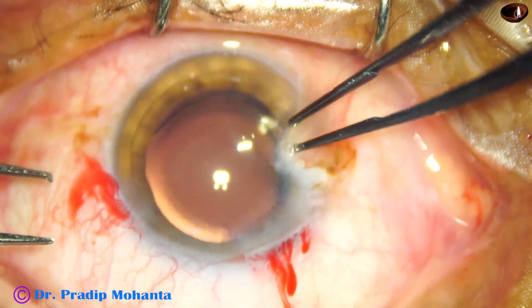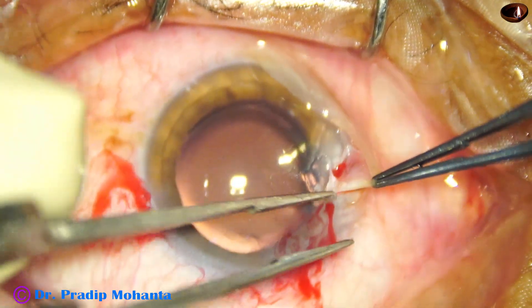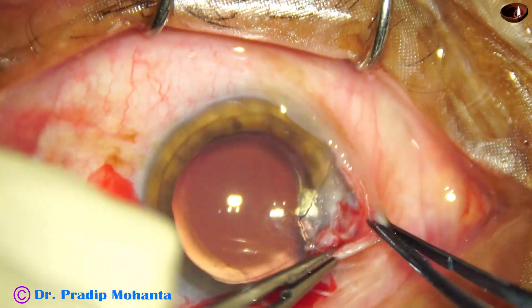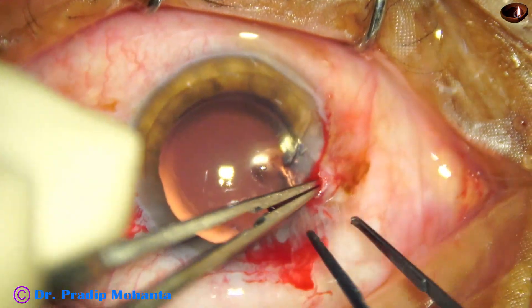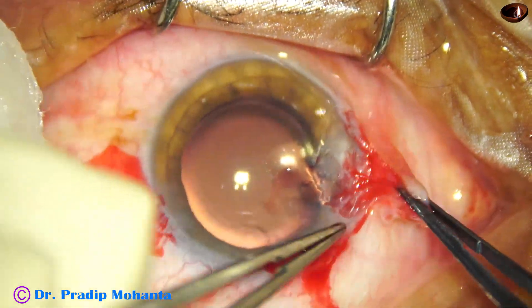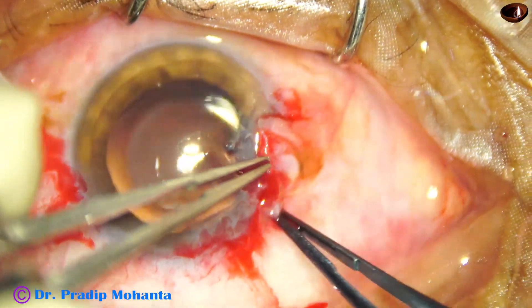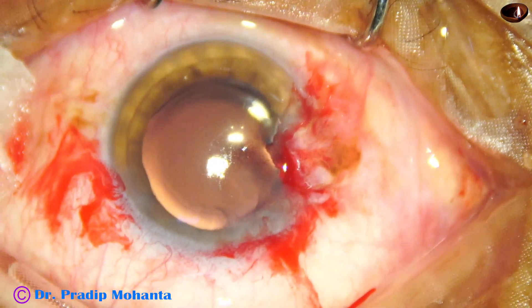Now pterygium is to be managed. I take two thick forceps and do pterygium rexis — that is, tear off the head of the pterygium. I have got a plane; along that plane some dissection is done. Some white tissue is attached to the cornea and has to be cleaned later on.